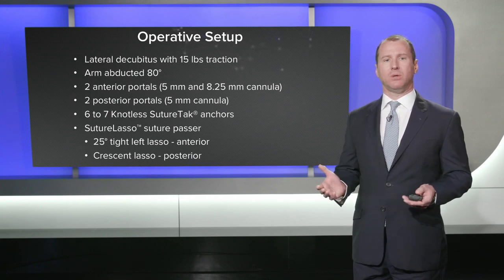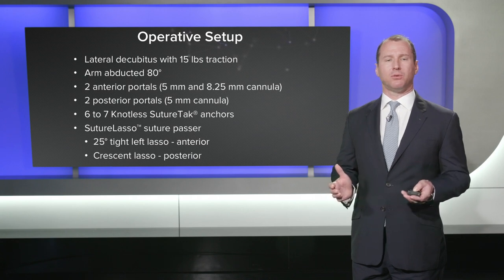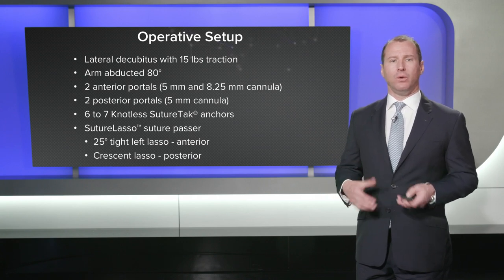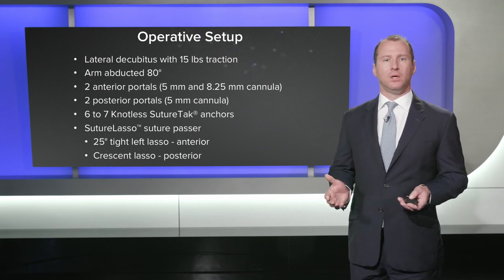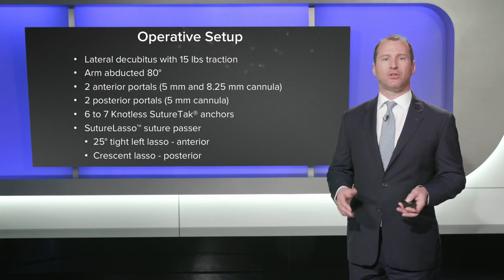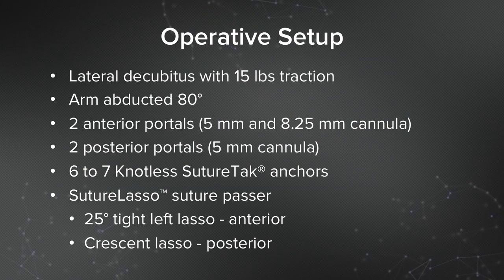We'll use six to seven knotless suture tack anchors for a pan-labral repair — at least three in the front, at least three in the back, and if there's room we'll put four in the area of the principal direction of instability. We use suture lassos: typically a 25-degree tight lasso anteriorly, and posteriorly a crescent lasso which fits through the 5mm cannula.